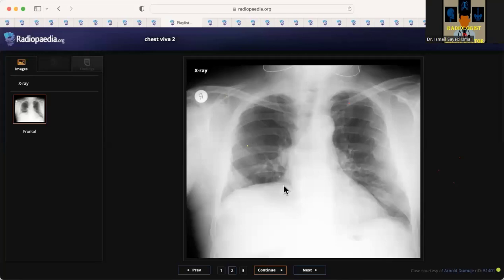And then we have the diaphragm causes, which you said could be a phrenic nerve palsy. Other causes could be diaphragmatic eventration. And then abdominal causes would be hepatomegaly. It could be metastasis to the liver. So there are multiple causes.